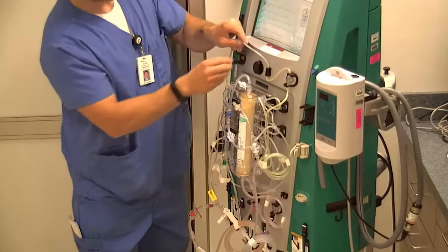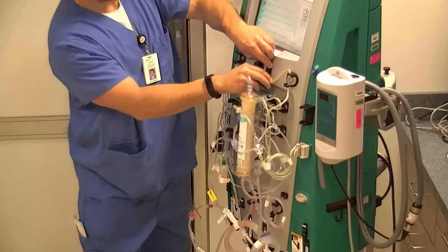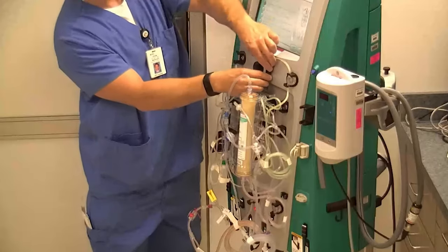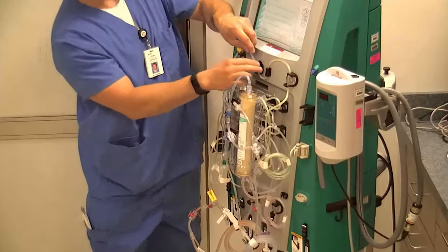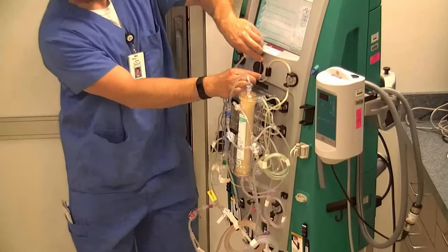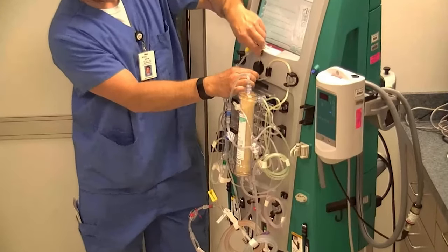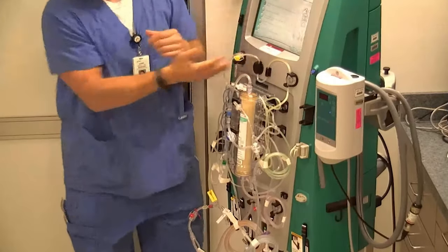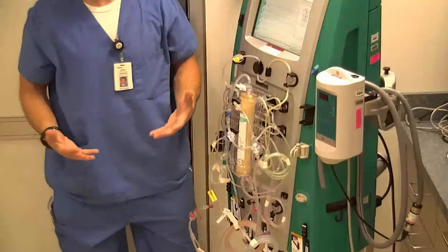And then you want to make sure that you're making this loop look, and actually I did that backwards. So we're going to flip it back around, snap that in, and you're going to take your tubing here into this blood leak detector. And what I recommend is flossing this back and forth like dental floss and sliding that all the way into the left. That will help prevent any alarms during the priming process.